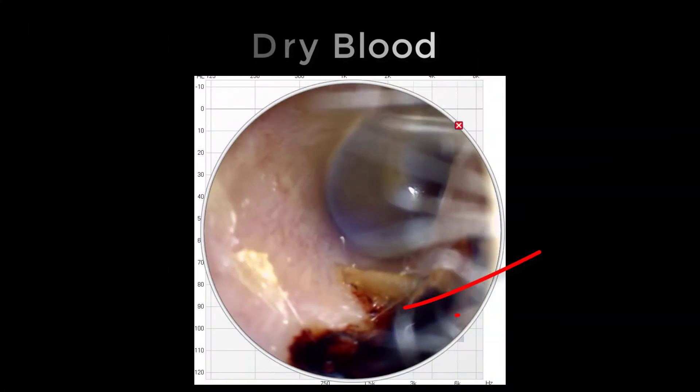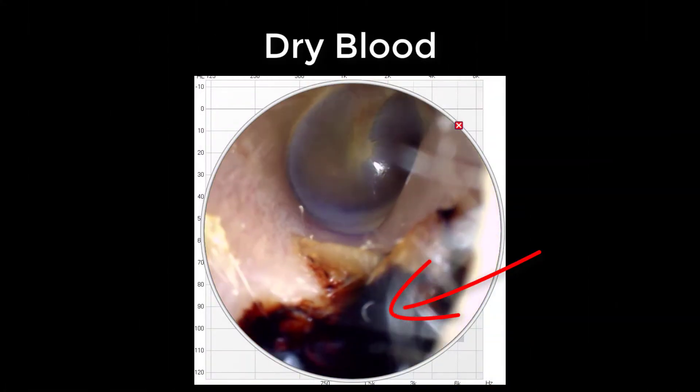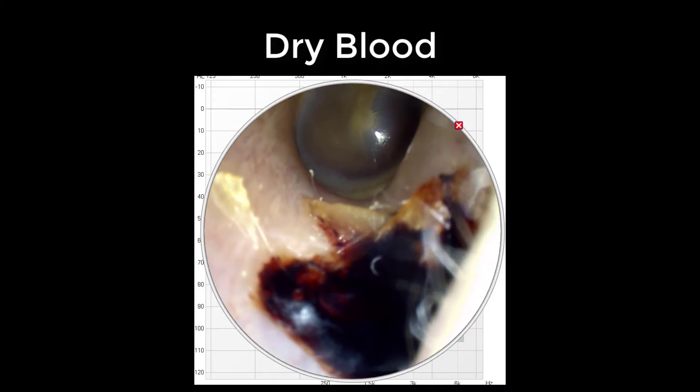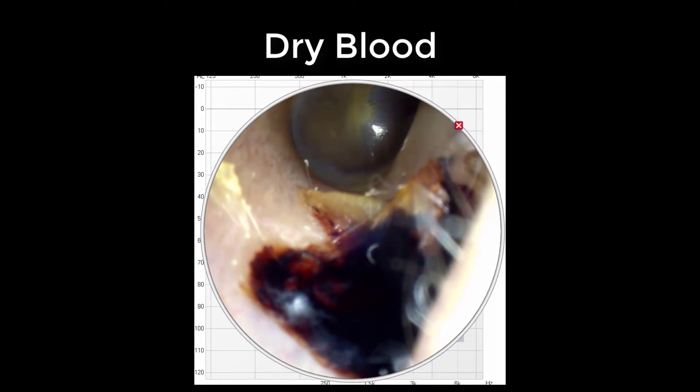Next, I'm gonna show you why cotton swabs like Q-tips are never recommended for cleaning out your ear canals. This dark area is dried blood in an ear canal after my patient scraped her ear canal with a cotton swab. Ultimately, she is lucky she didn't puncture a hole inside of her eardrum. This just goes to show how dangerous cotton swabs can be if you disregard the warning clearly printed on the packaging to never insert the swab into an ear canal. It is also the precise reason why you should never stick anything inside of your ears.